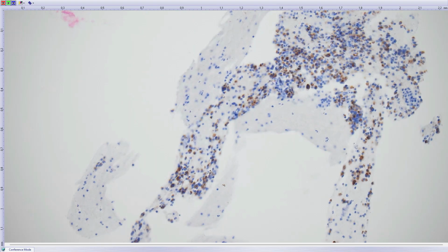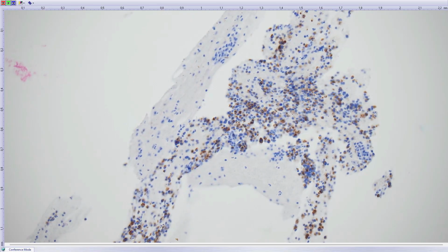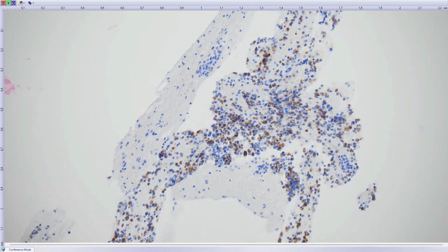So it's obviously a neuroendocrine tumor. INSM1 staining was also positive. I stained also for Ki67 to evaluate proliferation. I tried to do grading even from these small biopsies and cytology specimens, and this was graded as well differentiated neuroendocrine tumor grade 1 because there was almost no immunoexpression for the MIB1 antibody, and I did not find any mitotic figures. Okay, so pancreas: well differentiated neuroendocrine tumor.